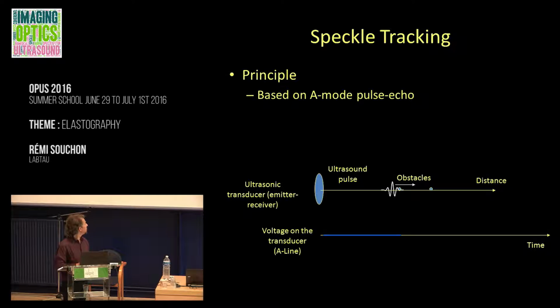So I'm now using my ultrasound transducer as a receiver, and the voltage on it, so it's converting pressure waves to electricity and to voltage so that I can measure it. Because I have not received any echo yet, the voltage is actually still 0. The wave has not come back. So I'll wait a bit more.